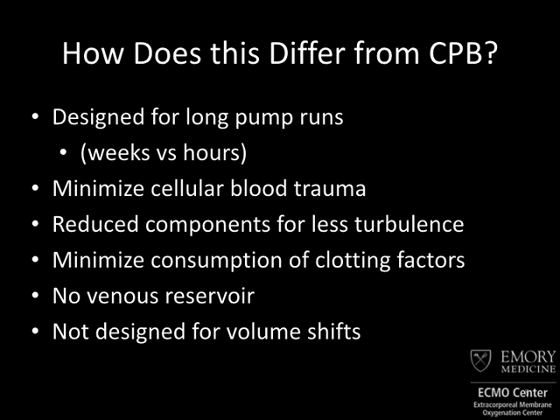The big difference that you see is in an OR, we have a large venous reservoir. And the reason you have this is because when we're doing cardiac surgery, there are times where we need to empty the heart out and we put all the blood into a reservoir. And then when we're done with whatever we're doing to the heart, we need to put the blood back into the patient. We empty the reservoir. ECMO is not designed for that. It's designed for essentially maintenance of flow. And as such, there is no venous reservoir, which also means that it's not designed for volume shifts. Meaning, if you need to give someone volume, you need to give it through something other than through the ECMO machine. And that's an important thing.